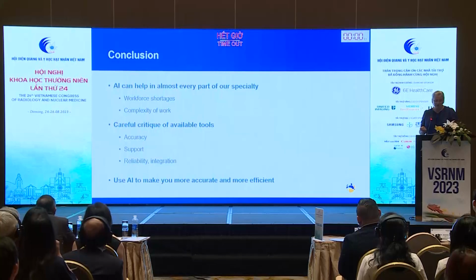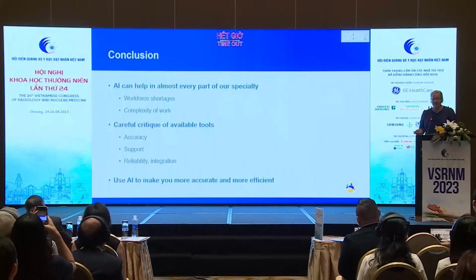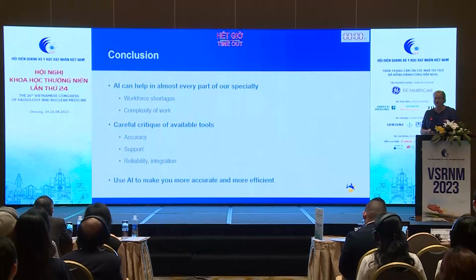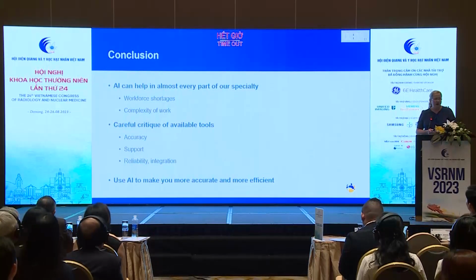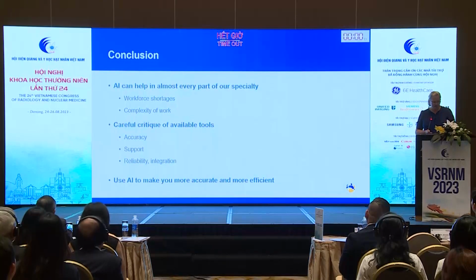So in quick conclusion, AI can help us across our specialty in almost every part of the patient journey through radiology. It is important to ask questions about any tool, especially AI. Ask to see the evidence, ask to see about accuracy, find out what level of support you can get from the AI company, and find out how reliable it is with integration.